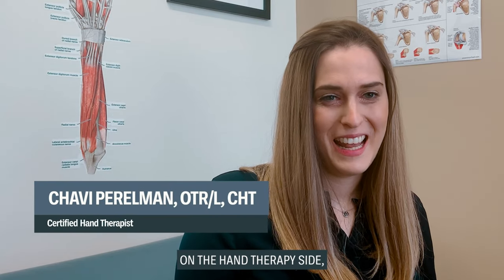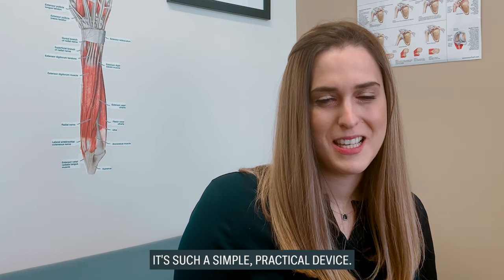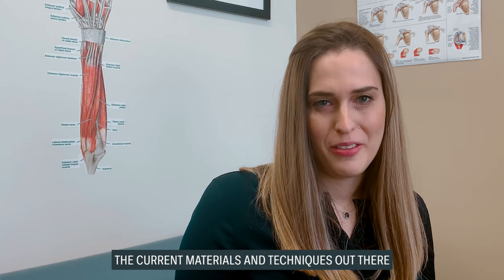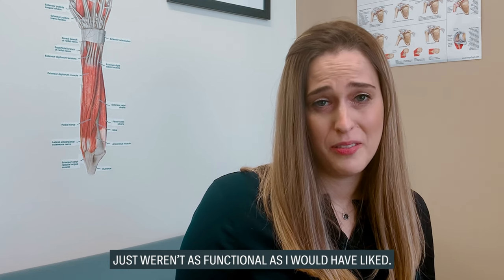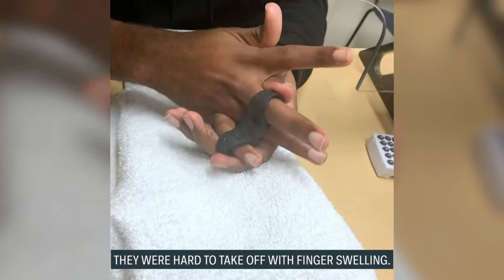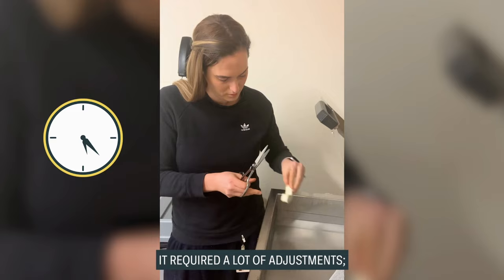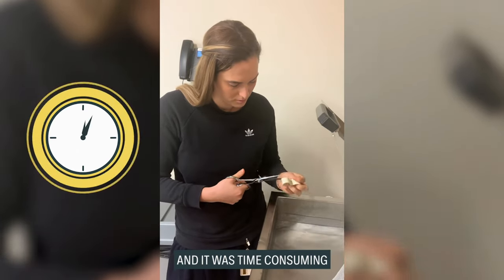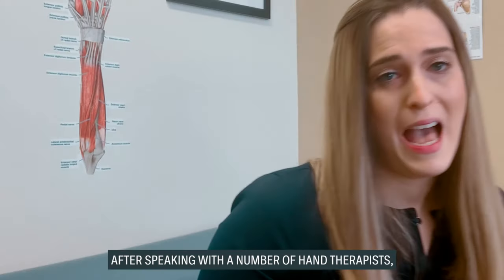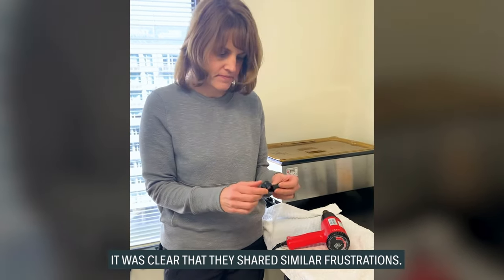On the hand therapy side, I definitely saw the benefits of the relative motion orthosis. It's such a simple, practical device, but the current materials and techniques just weren't as functional as I would have liked. Orthoses were often bulky and too rigid. They were hard to take off with finger swelling, difficult to clean and keep dry. It required a lot of adjustments, was time consuming, and ultimately patients just weren't happy. After speaking with a number of hand therapists, it was clear that they shared similar frustrations.